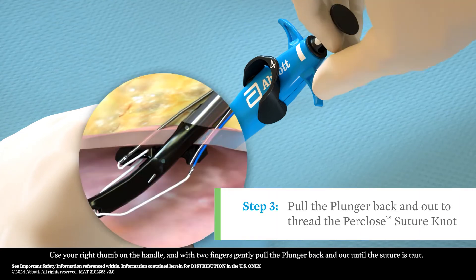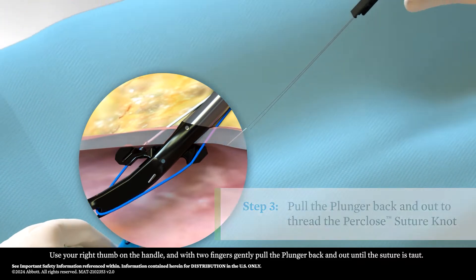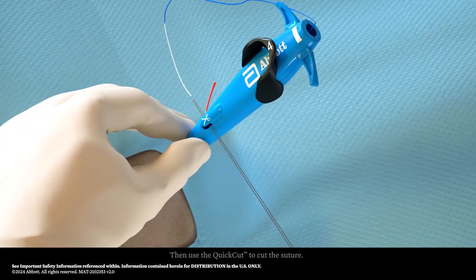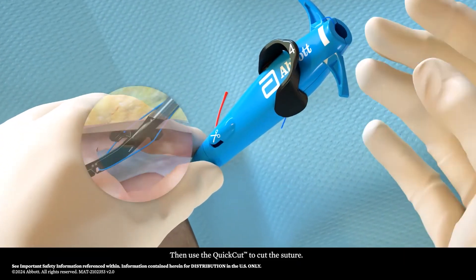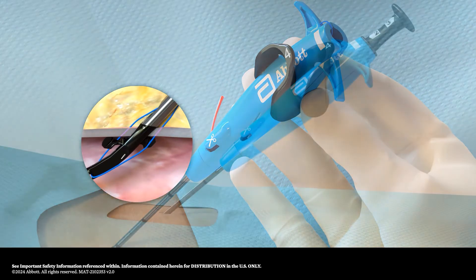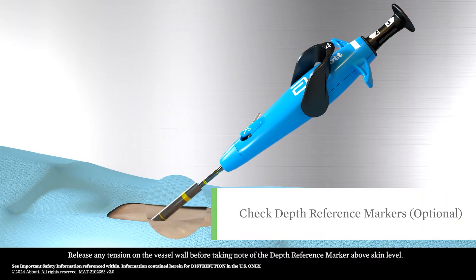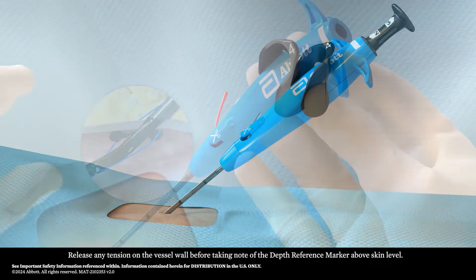Use your right thumb on the handle and with two fingers, gently pull the plunger back and out until the suture is taut. Then use the quick cut to cut the suture. Release any tension on the vessel wall before taking note of the depth reference marker above skin level.